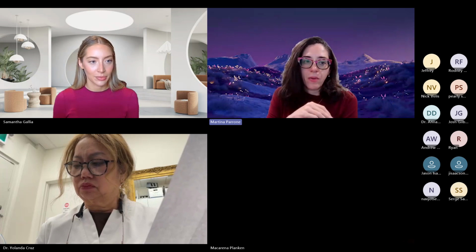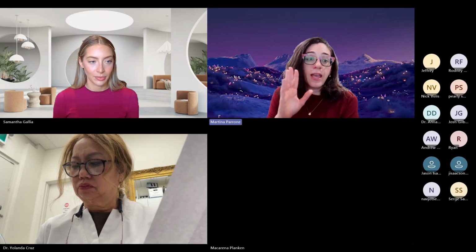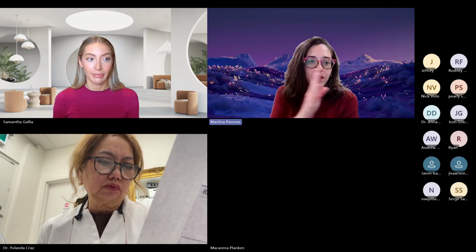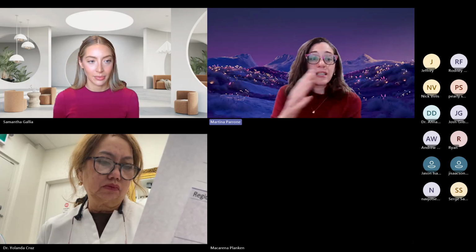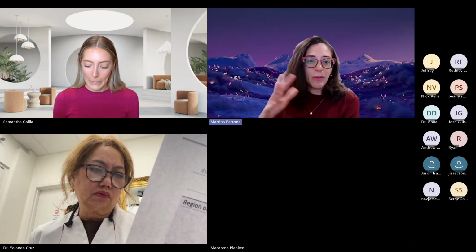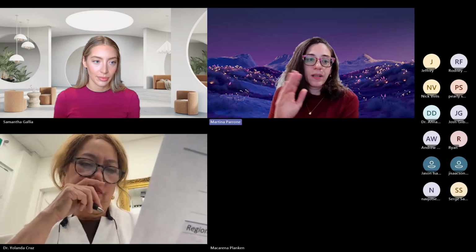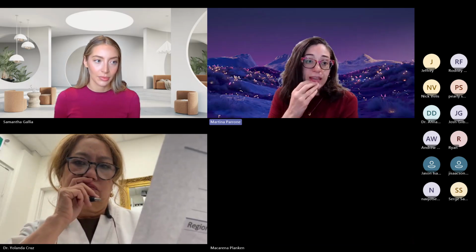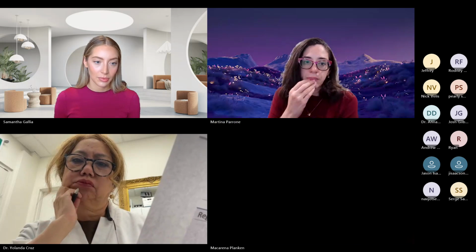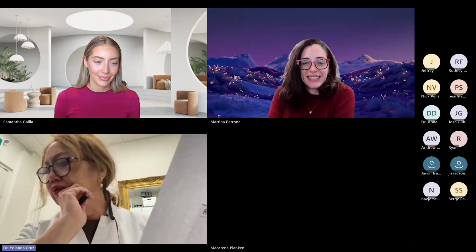If it's clinically stable, I would 100% trust that. I see implants that I am 100% sure are not all the way in bone, that are rock solid and have been rock solid, because we see CBCTs over time, and I'm amazed sometimes at implants being stable given what I see relative to the bone. Even if they're not in the bone, I would trust your clinical findings more than a CBCT in terms of whether I am going to redo it or not. Yeah, great question.